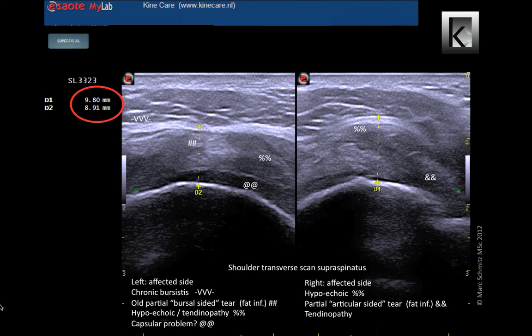This is a supraspinatus of a sixty-year-old laborer with complaints since two months on the right side due to a probable partial tear, with as a result the intratendinous swelling. Hence, the darker hypoechoic color and increased thickness of the tendon. The tendon is 9.8 millimeters. The normal average is 5 to 7 millimeters. Relatively, this is a big increase which influences the subacromial space with as a result a subacromial impingement.